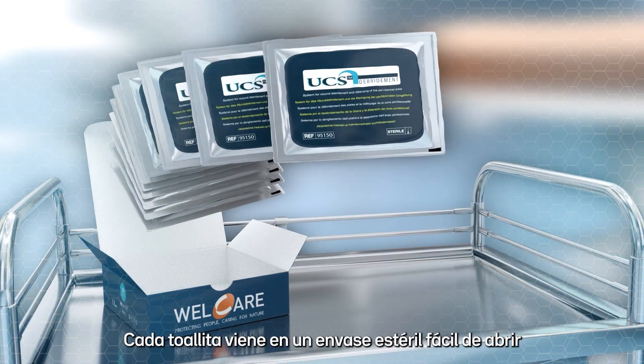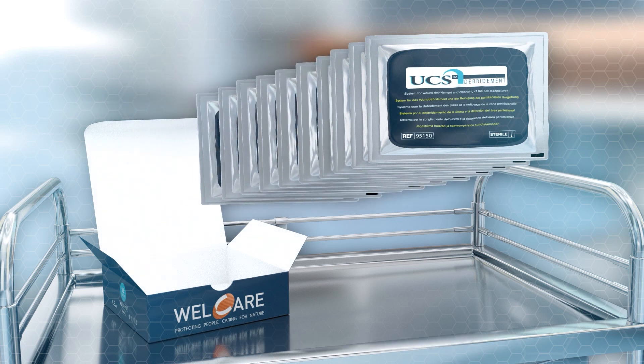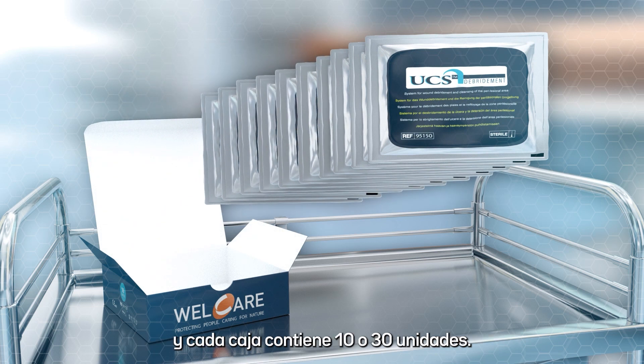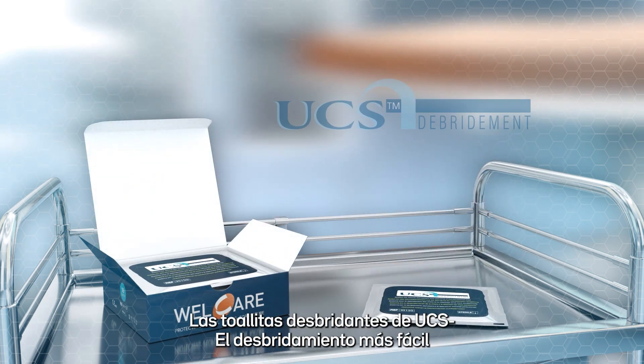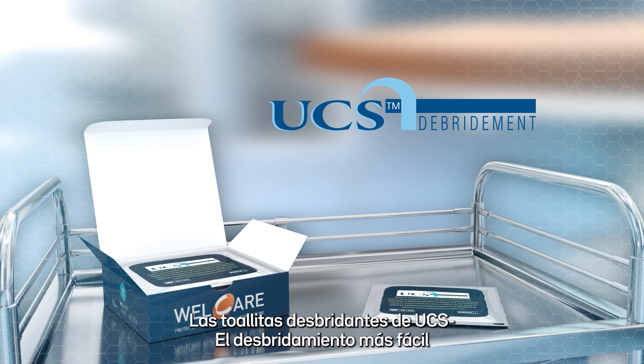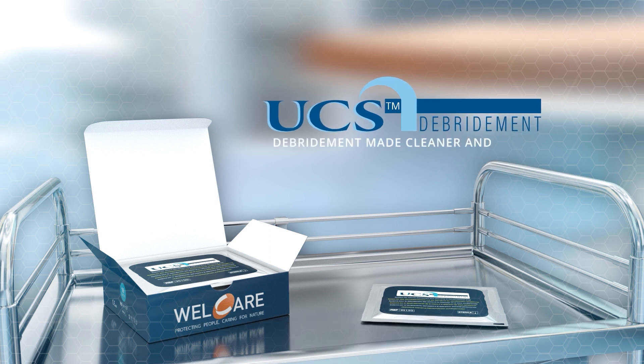Each cloth comes in an easy to open sterile foil pack and is supplied in boxes of 10. The UCS debridement cloth — debridement made cleaner and easier.